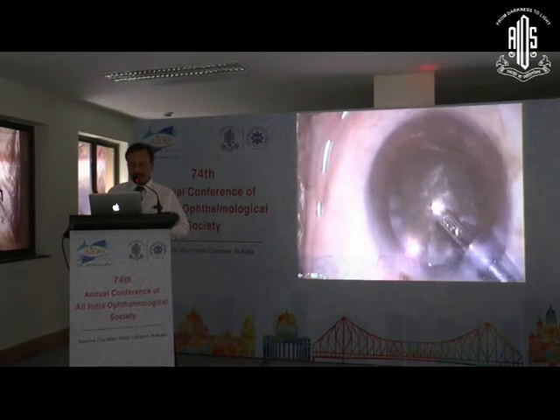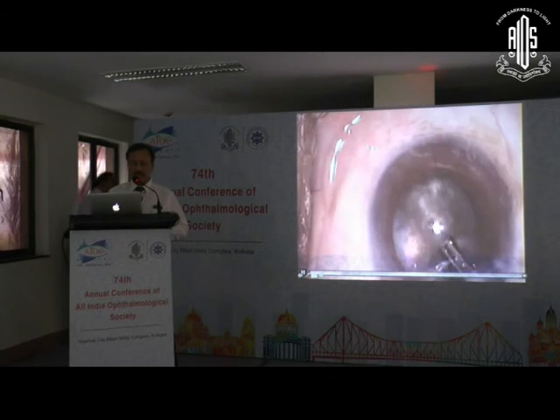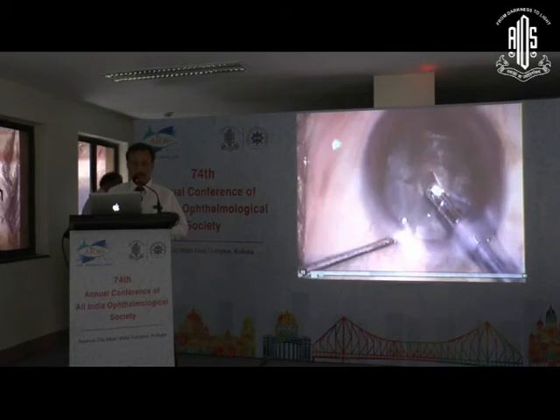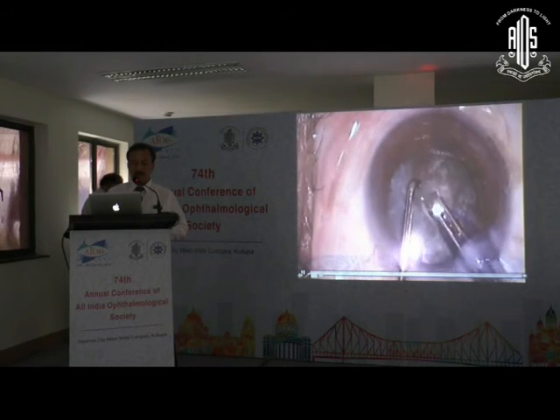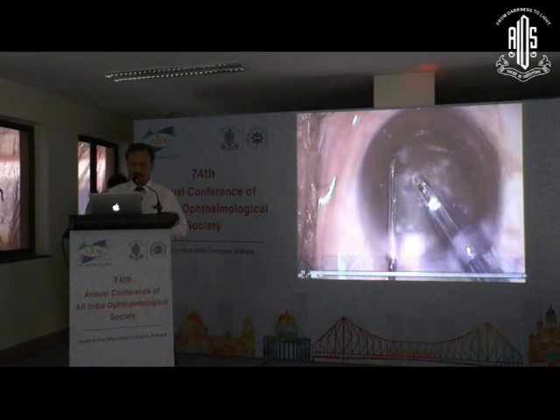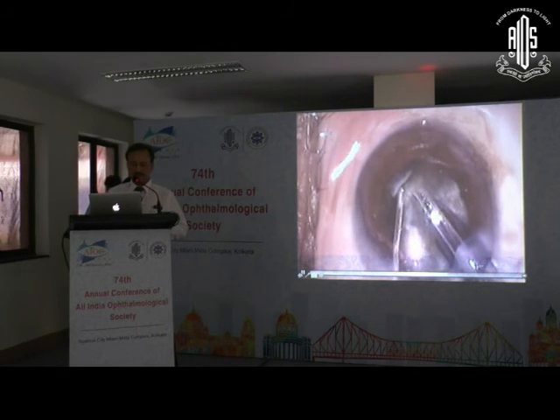I'll just omit this video and look at this video. A very hard and black cataract. But what you have to look at here is a small trench is made, and then see the movement of the phaco probe. You have to go superficial, you don't have to go deep. That is the most important part in this technique, because you have to go superficial. Look at the movement, it's so superficial. You are going within the nucleus surface, and then hook the periphery with the chopper.